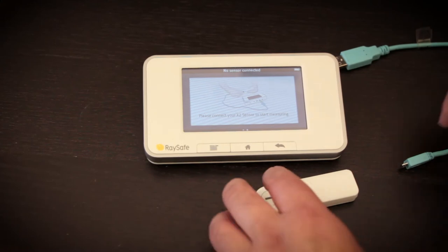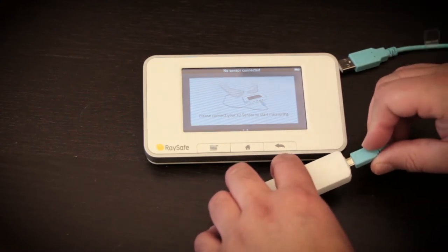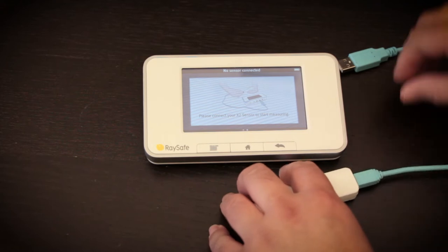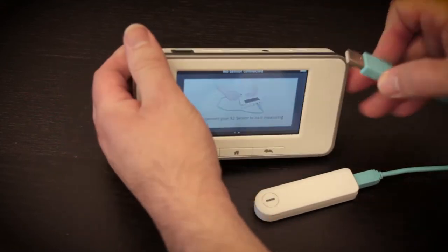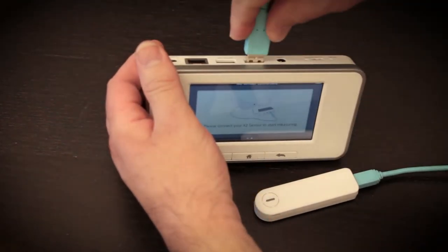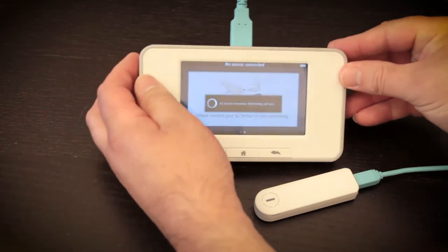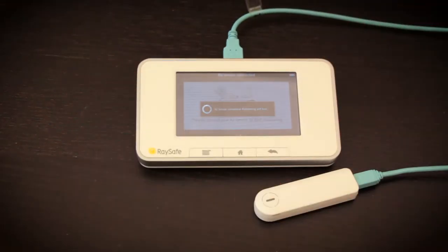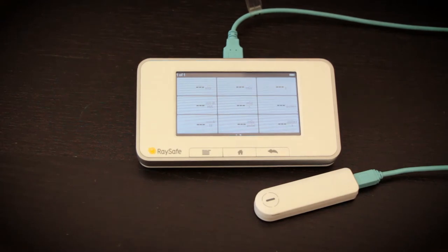First, we connect the RF sensor. And by the way, RF means rad and fluoroscopy applications.